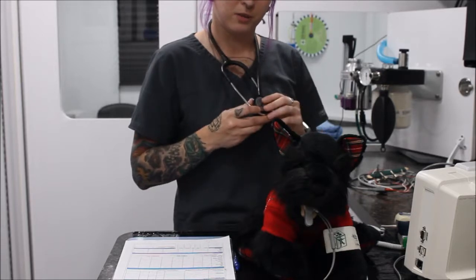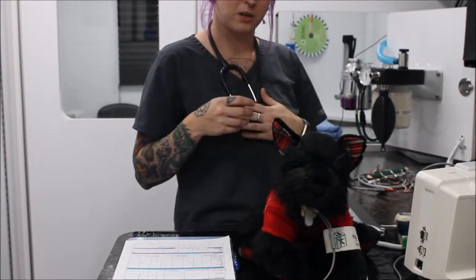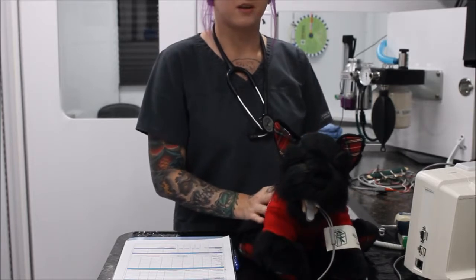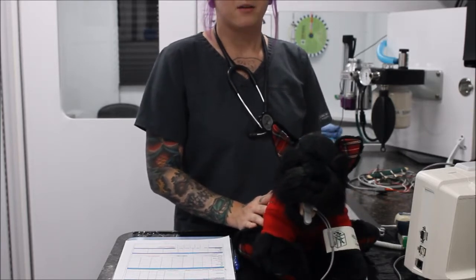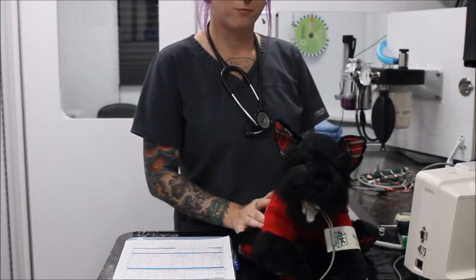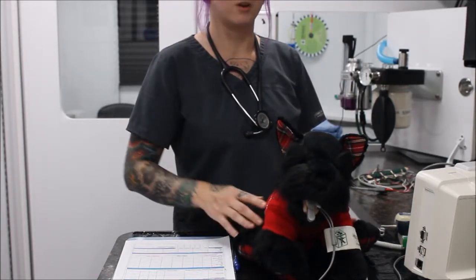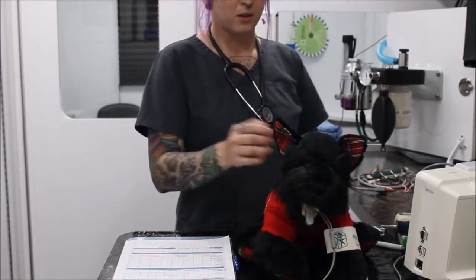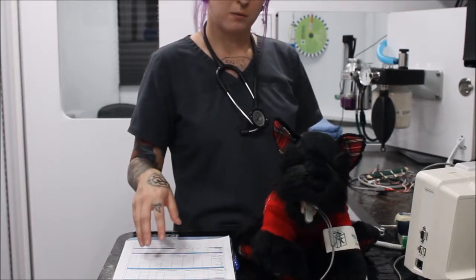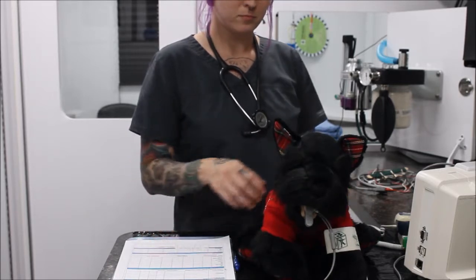And you can also listen with your stethoscope if you can reach in there during the procedure. So basically, one way to get the respiratory rate is by counting the respirations for usually about 15 seconds and multiplying that by 4, and that usually gives you your respiratory rate. So normal respiratory rate for dogs and cats is about 8 to 20 respirations per minute.